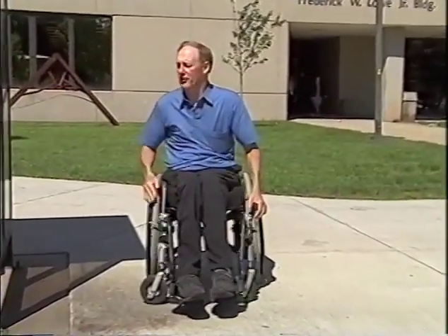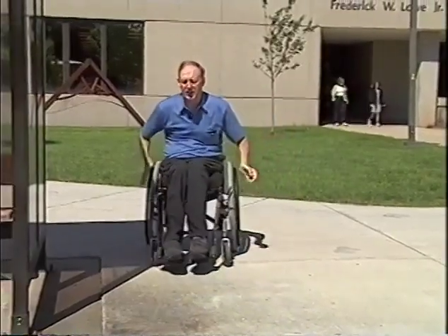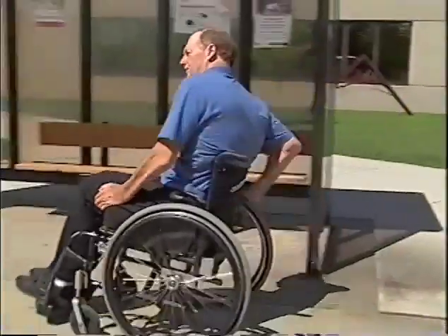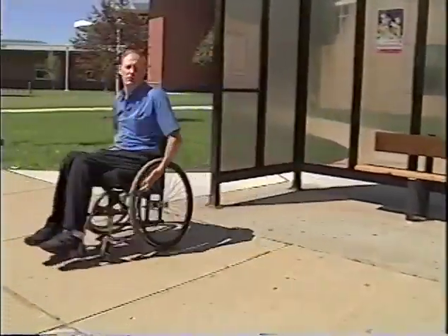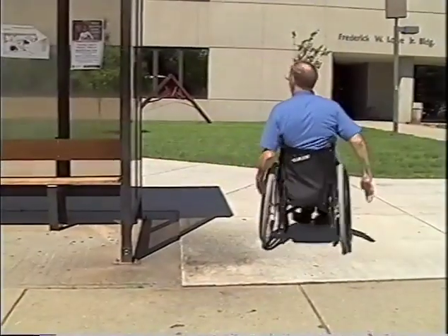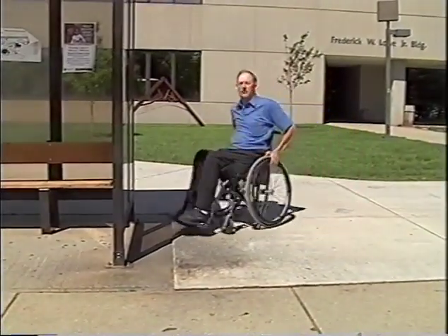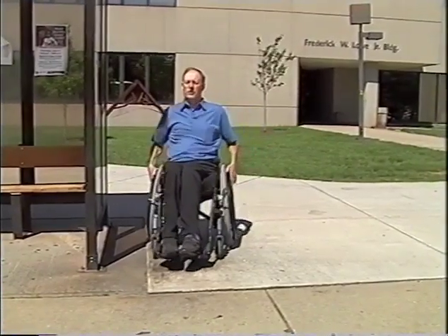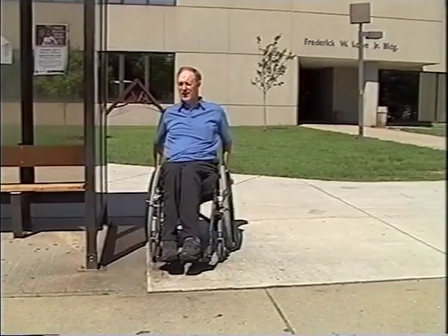The third method of cornering is to simply come to the corner. If you have something around you, lean back and touch the corner. So you can corner very easily and not lose your speed. What you're doing is, when you're done pushing, you should be on the back of the chair.